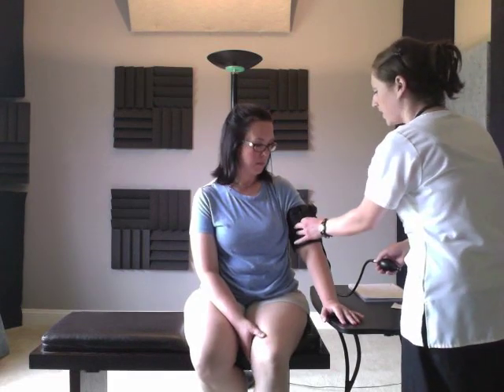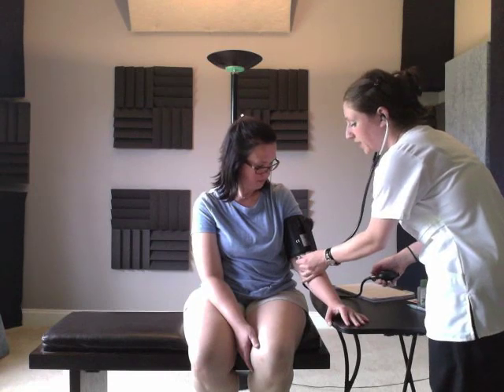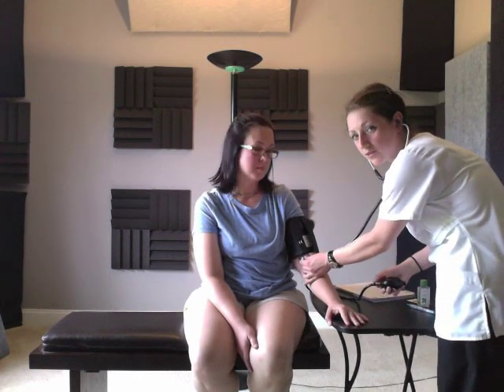Allow approximately 15 to 20 seconds for your patient's arm to reperfuse. After this time frame, apply pressure, but this time exceed the pressure by 20 to 30 millimeters beyond the point where the pulse was no longer felt. Prior to reinflating the cuff the second time, clean your stethoscope with an alcohol pad for asepsis. Once your stethoscope is clean, place it in the location over the brachial artery. With your stethoscope securely in place on the patient's skin, you are ready to reinflate the pressure to the desired range for your patient.